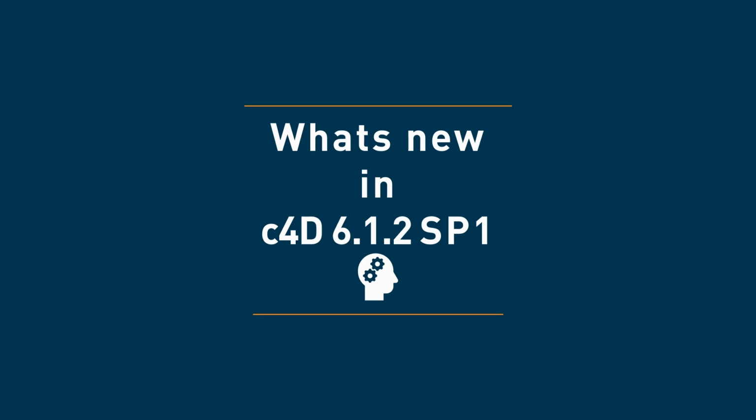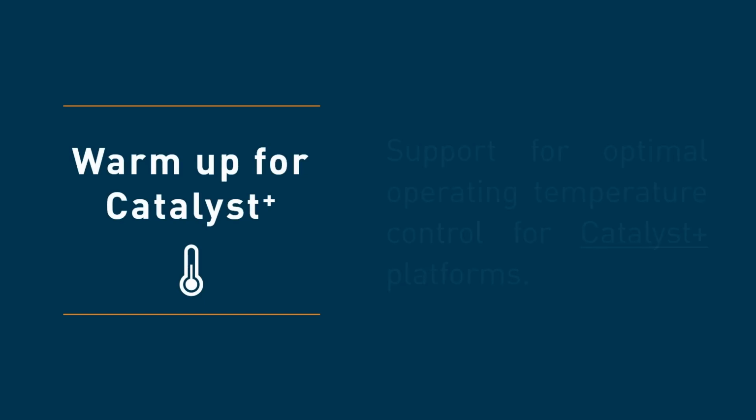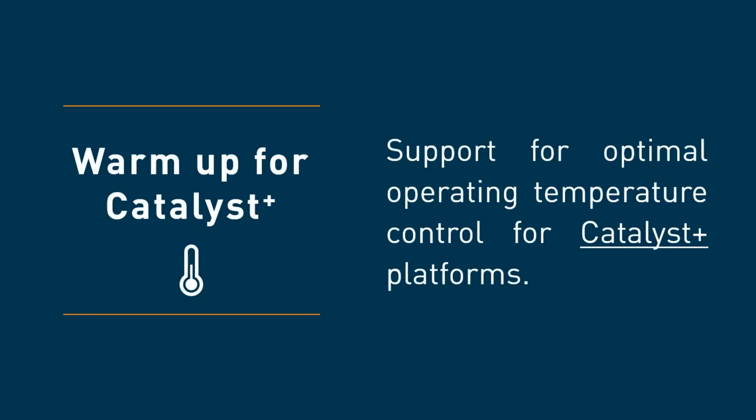Let me start with the upgrade for 6.1.2 Service Pack 1, which is delivered in the c4D build 6.1.2.8144. There is one main change in the software, which is temperature control for Catalyst Plus, and one relevant bug fix, which was done for the special character issue from earlier versions of c4D. Since we have seen a significant drift of the isocenter due to temperature rise during clinical operation, we have improved the temperature control of the Catalyst platform.